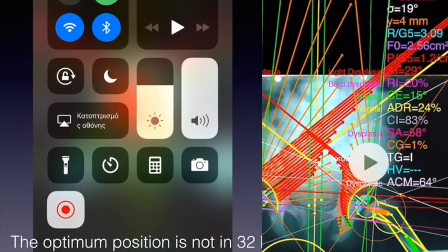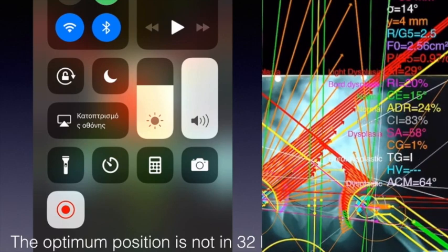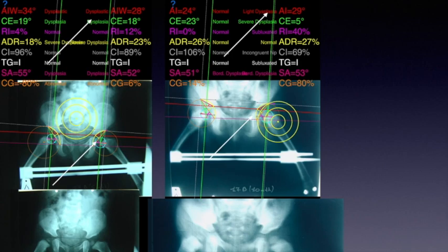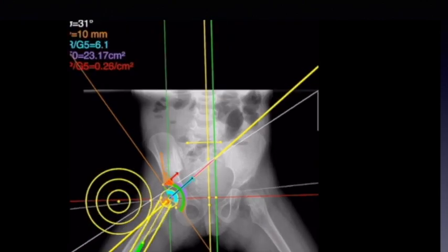This procedure helps decide in an instant the optimal position of abduction of the extremity by changing the abduction of the brace to the suggested advantageous degree of abduction, without repeating X-rays. This will promote uniform remodeling of the dysplastic acetabulum towards normal, saving time for a successful outcome.